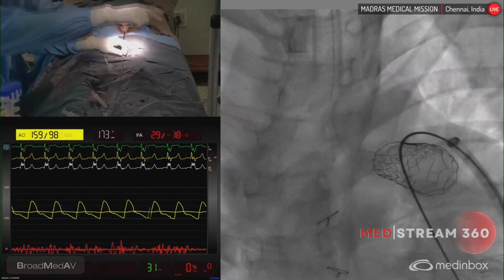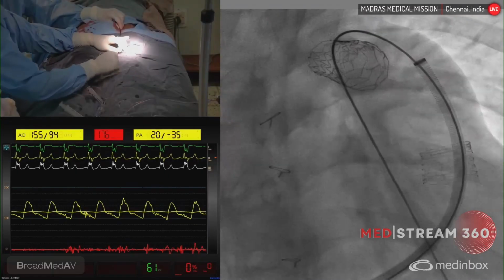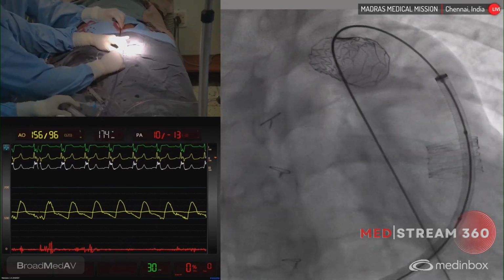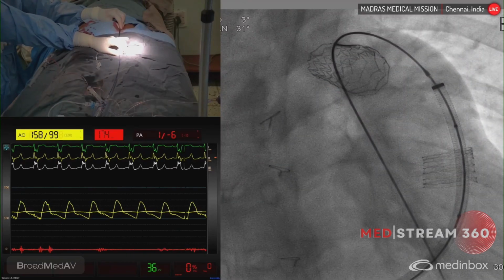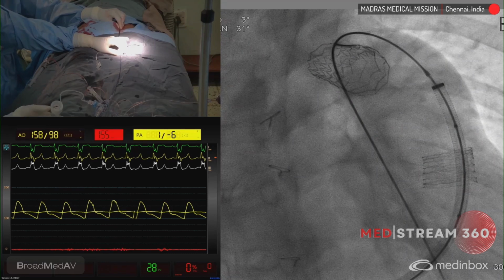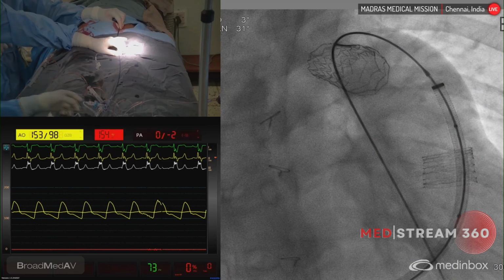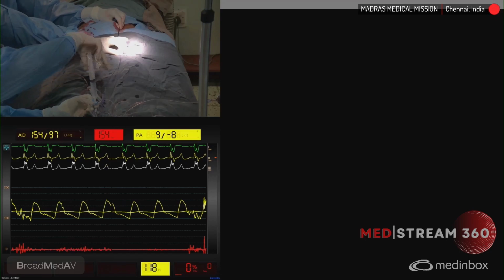Okay. Other than this, can we get the main pulmonary artery stent, please? One of the balloons that is commonly used around the world is Atlas. And Atlas has got two versions, Atlas Gold and the regular Atlas. Atlas Gold has got a shorter taper. This is one balloon that goes up to around 16 to 18 atmospheres. The second balloon is the True balloon. And the third one is the Nucleus balloon. All these three are very high pressure balloons available in the larger dimensions.